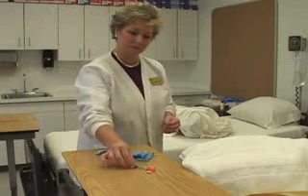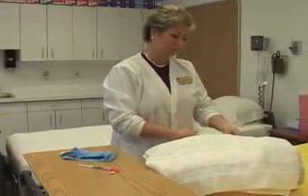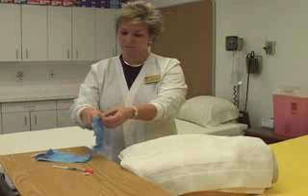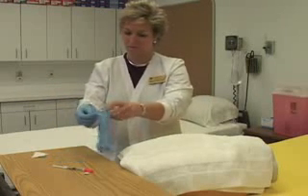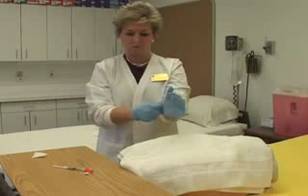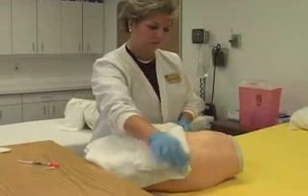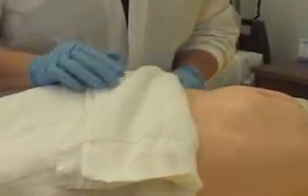At the patient's bedside, perform hand hygiene. Verify correct client. Explain procedure to client. Apply non-sterile gloves. Locate the injection site. Use the abdomen on lab simulators, choosing site no closer than 2 finger breadths from umbilicus. Avoid abdominal area above the umbilicus.